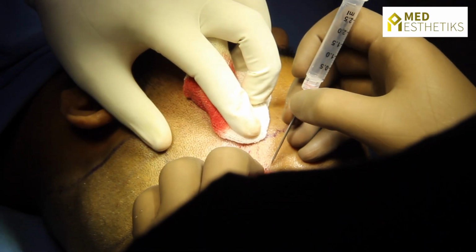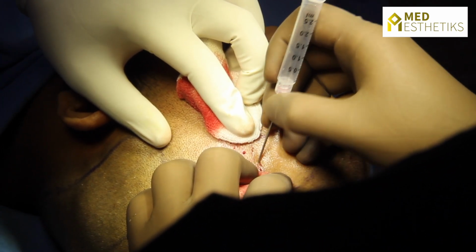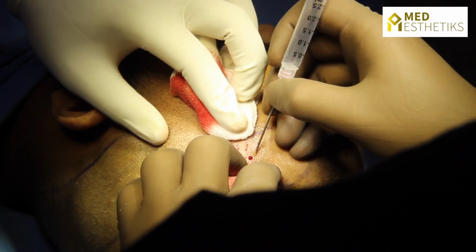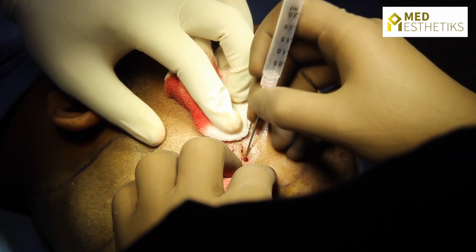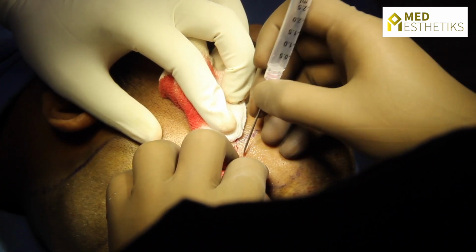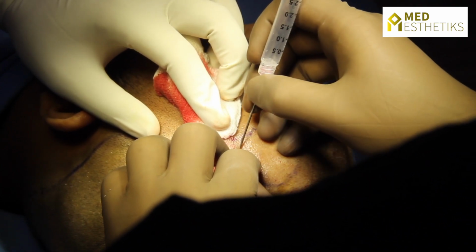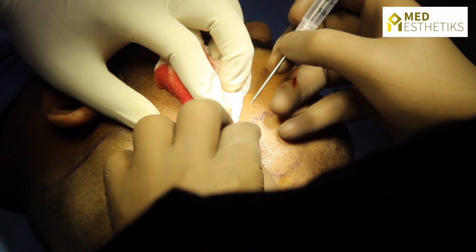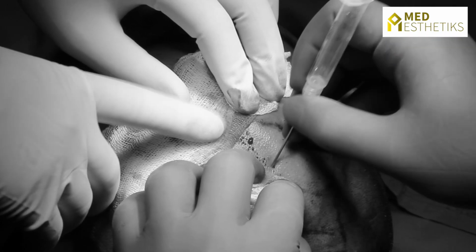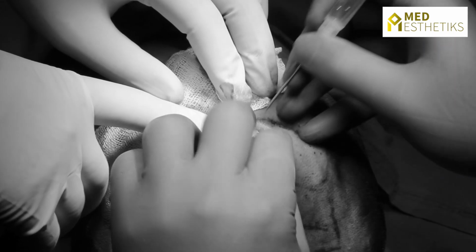We will be making slits first. In these slits, we will be putting the grafts which we will be taking from the donor area. The slits are made at a particular angle based on the site where they are being made. The slits in the frontal area are placed with a very high density so that we can give a very natural appearance to the patient once his hairs grow after the result.